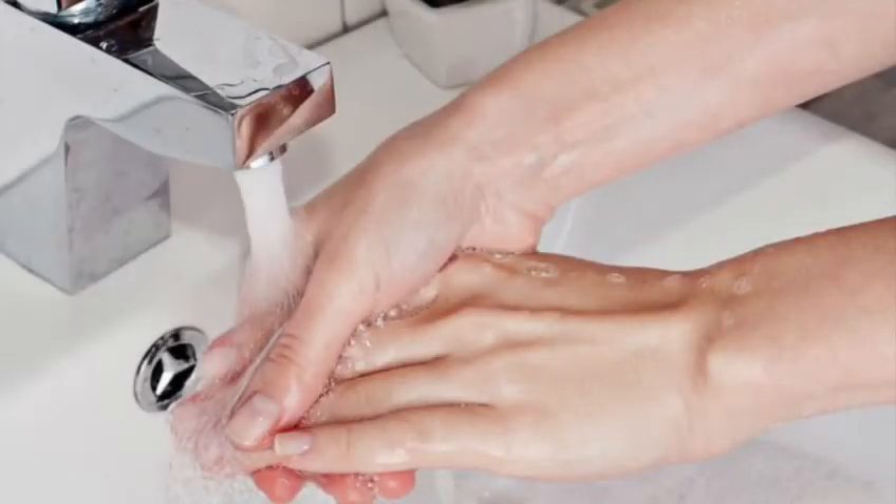Before you start, you need to wash your hands with warm water and soap. Avoid using hand sanitiser or baby wipes as these can leave a residue on the hands and give a false result.